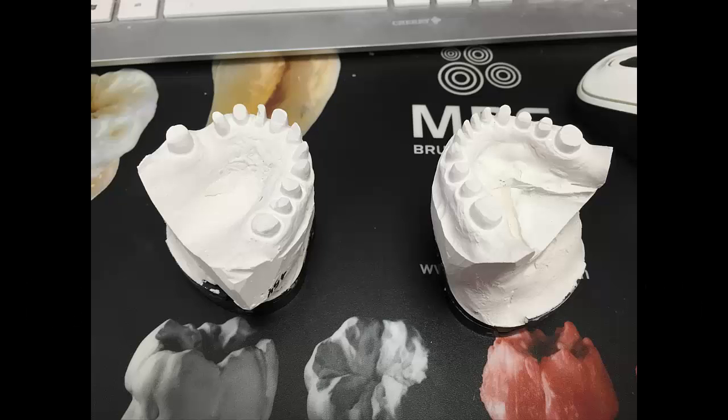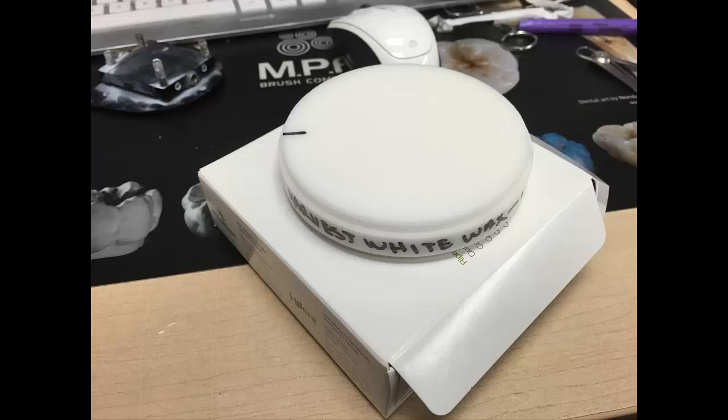With our conventional stuff, we actually have our models — the doctor sends us his pre-op models. Once he sends us his pre-op models, we actually prep them and scan them with the Ineos X5. Once they're designed, we export it to our CAM software and use the Harvest White Wax to mill out most of our Aesthetic Wax-Up. It's a pretty sturdy wax, but you can actually carve to it if you want to add your own flavor.